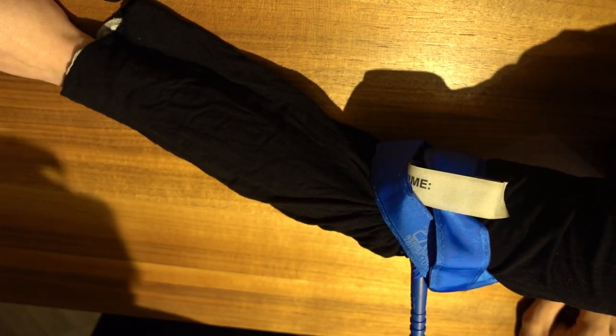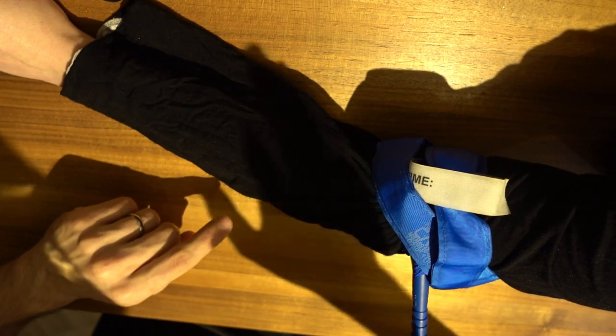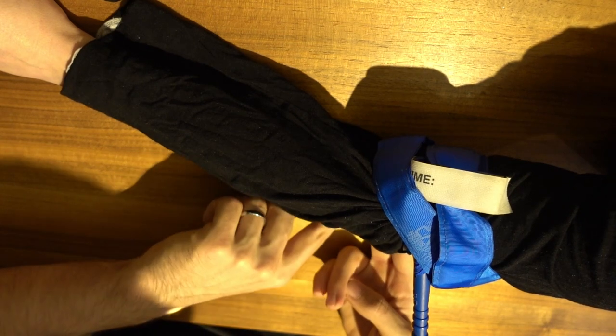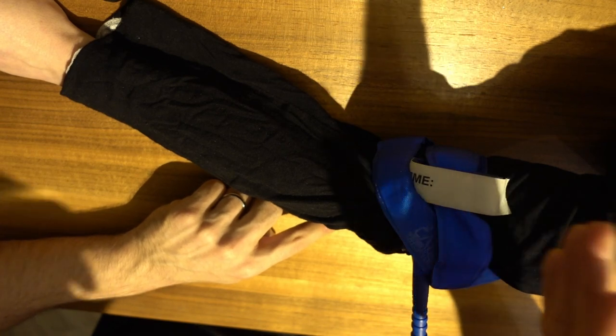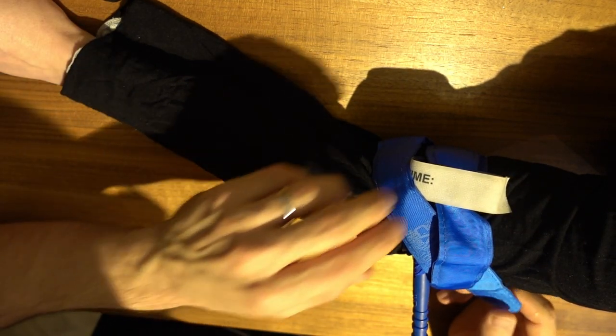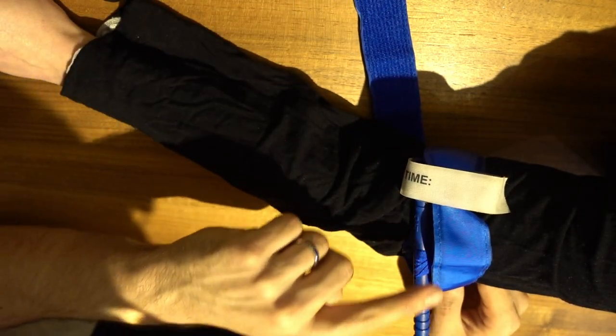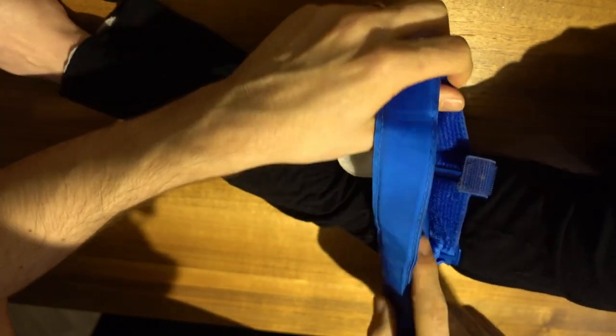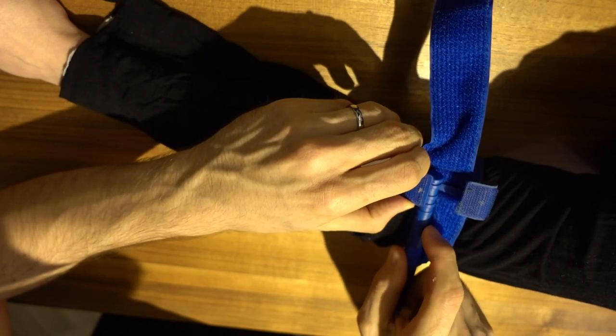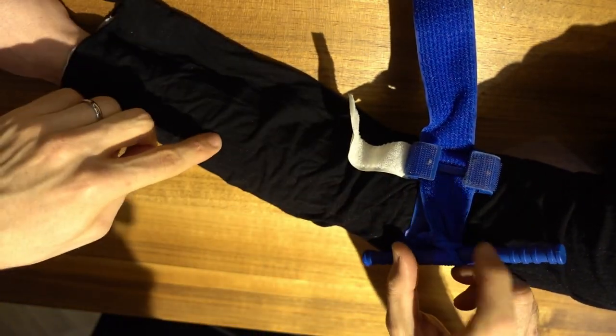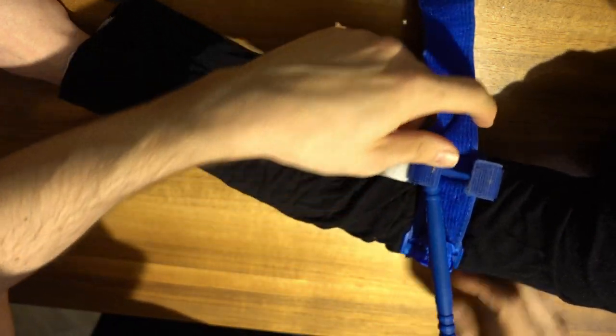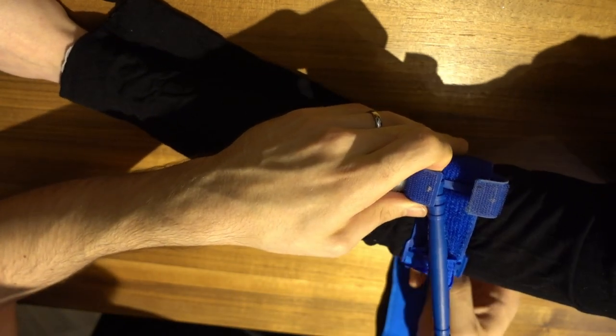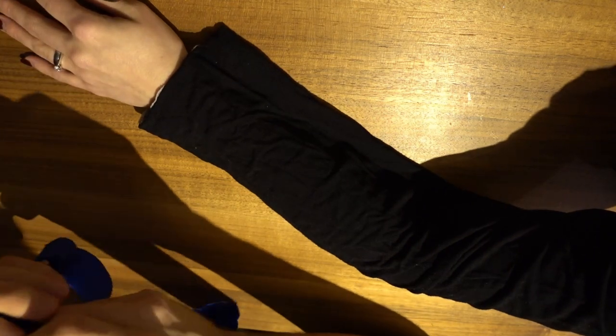The person should not bleed out. If you don't have the desired effect, you might have to apply a second one just below it. It's a bad spot if there's a joint under it, and you shouldn't deploy it on a joint. But assuming it is high and tight, just put one below and that should do the trick if the first one doesn't. So now we know you shouldn't remove it on your own. This is training so I can do it. What you want to do is gently open it up slowly. You don't want all the blood rushing back in at the same time. Slowly open the windlass, then you can remove the other part. That's all there is to it. Training is key.